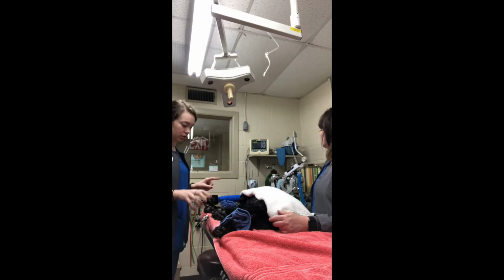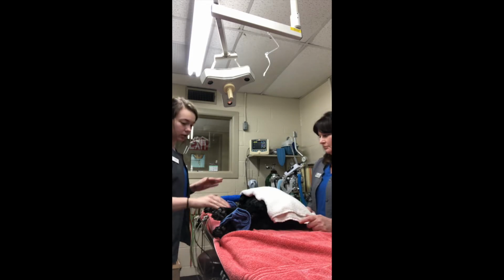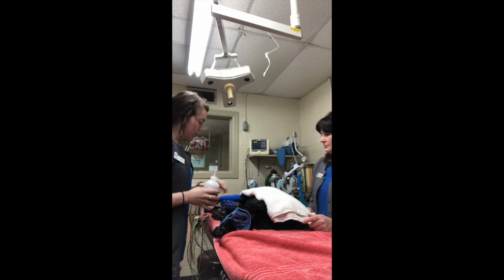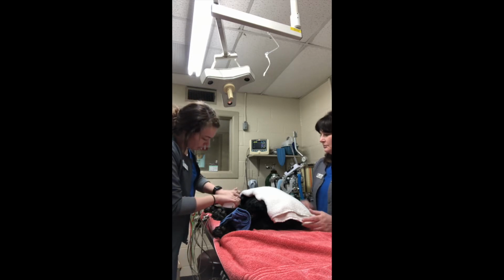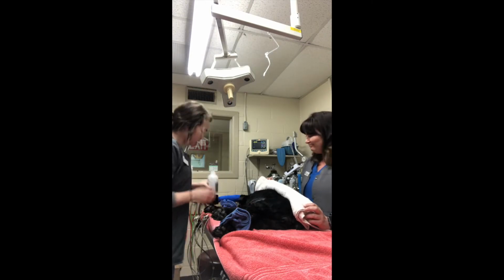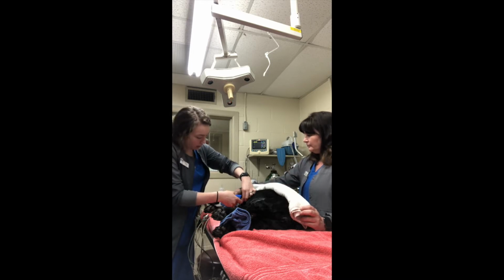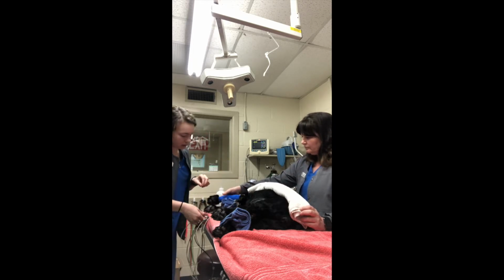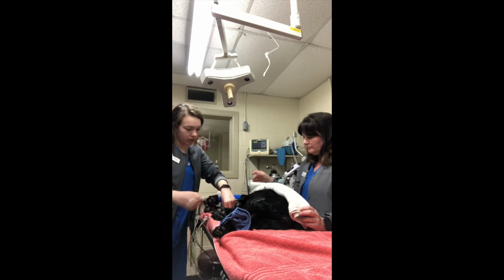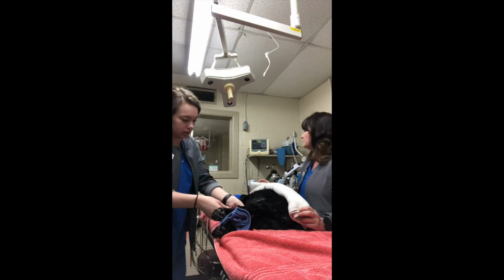Okay, we're going to get an ECG on this patient. We have her in right lateral recumbency. We have towels between her legs, so her legs aren't touching each other, and so the probes don't touch each other. I'm going to soak the area of her legs that the electrodes are going to be attached to. So the black is going to be on the front left, and you want to do it 1 inch to 2 inches away from the elbow. And the white is going to be on the front right. Red's going to be on the back left, 1 inch or 2 down from the stifle, and green is back right.